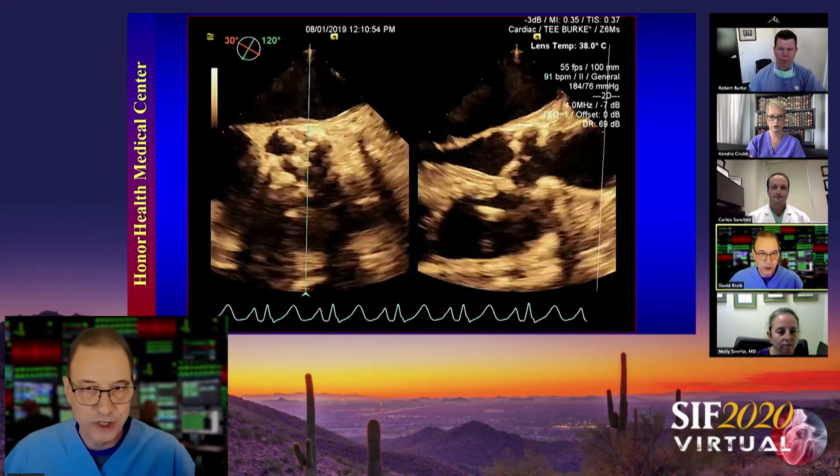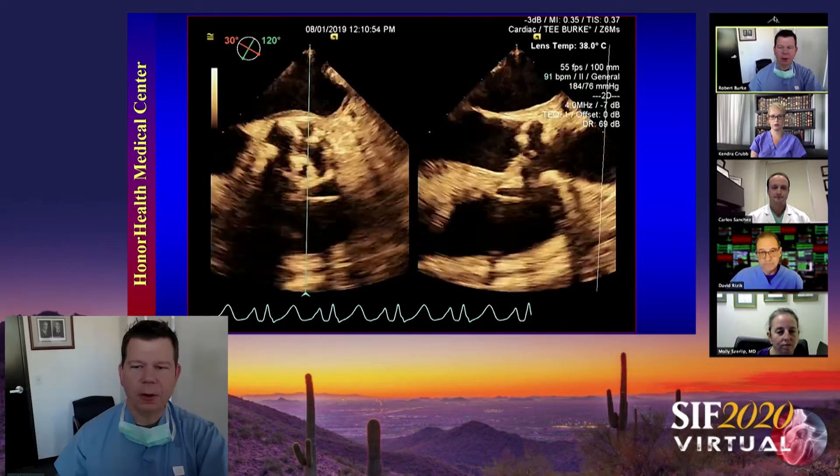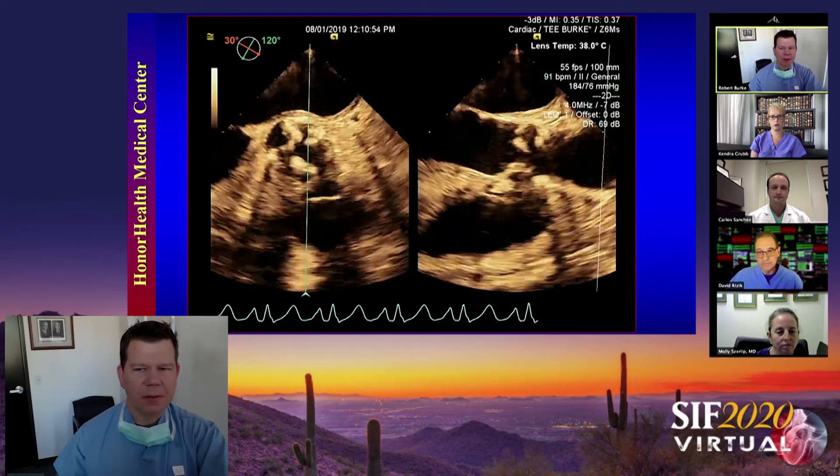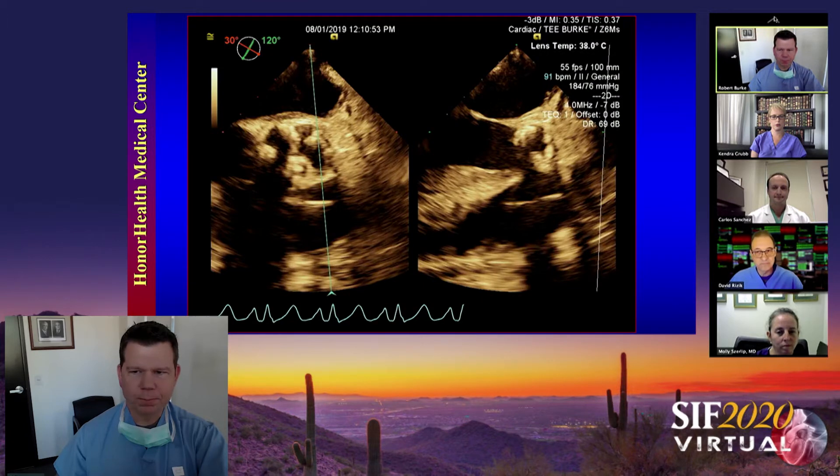Bob Burke, what are you seeing here? We're seeing a pretty calcified tri-leaflet valve. The STJ looks calcified and maybe a little bit small.